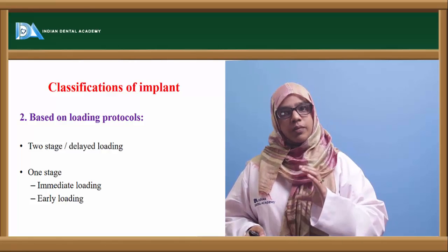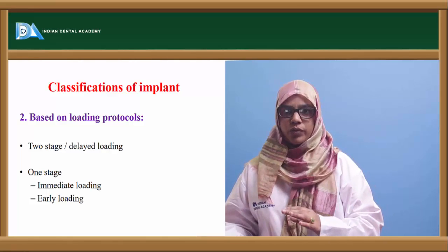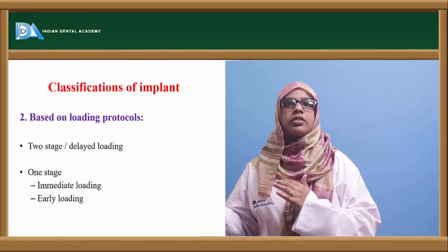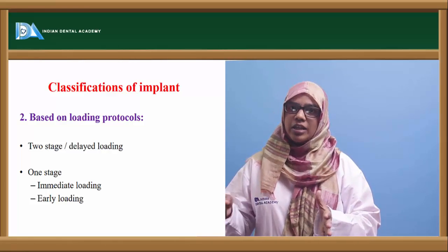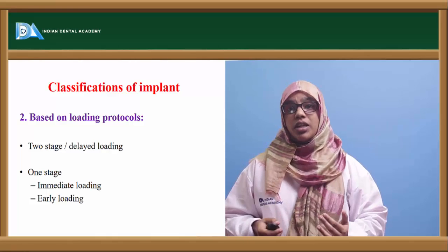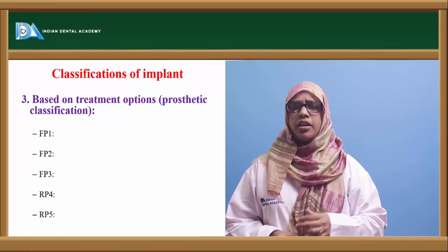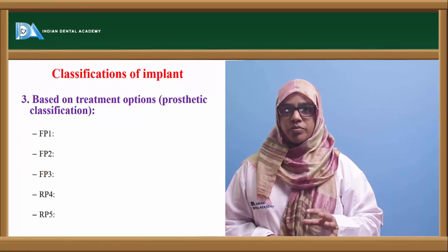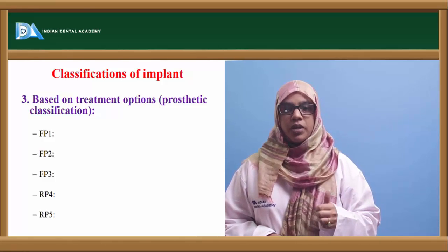Then you will keep the prosthesis in occlusion, and tell the patient to have a soft diet for 1 to 2 weeks. Then after another 1 to 2 weeks, tell the patient to have a normal diet. So you are incrementally increasing the stress, which is termed progressive loading, which is nowadays the current concept of loading the implant.